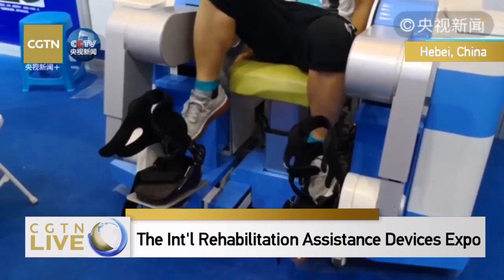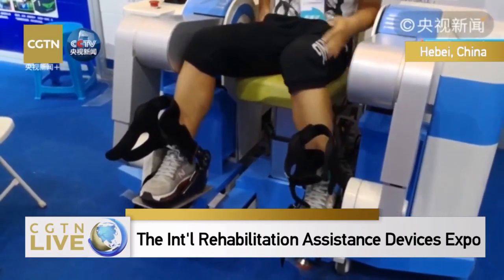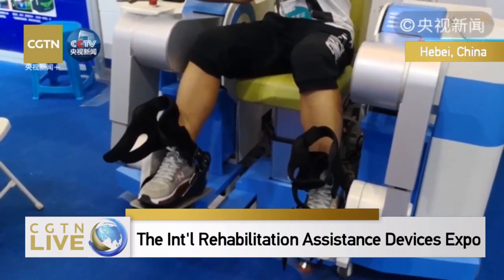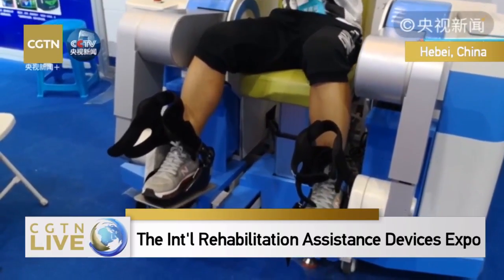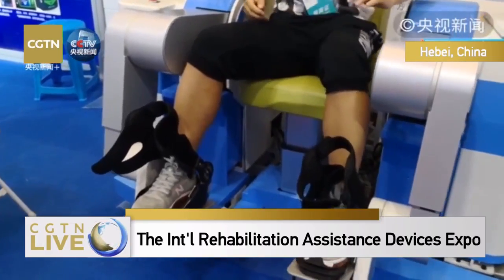Most of these devices will be used at the rehabilitation centers or hospitals. Most of them will not be suitable to use at home because these devices are too big.